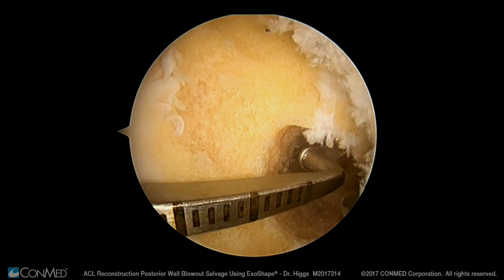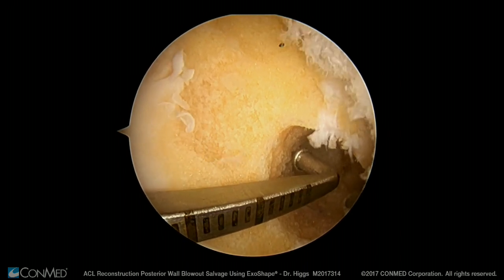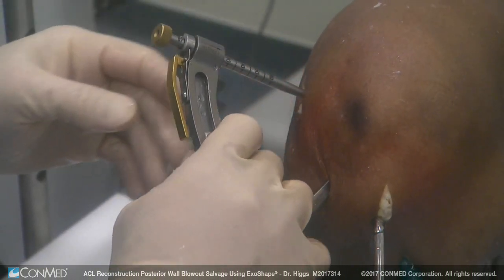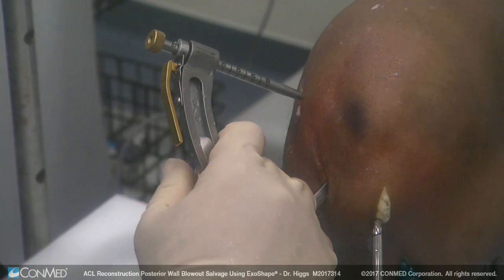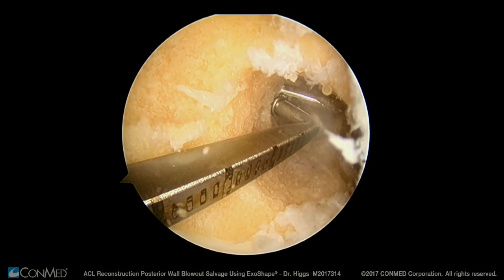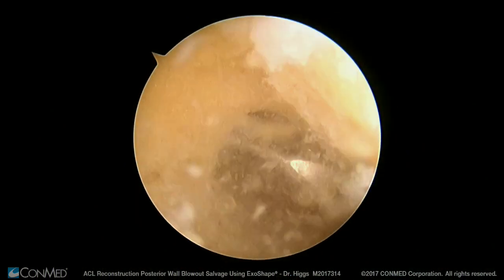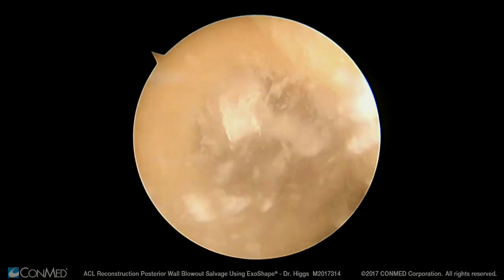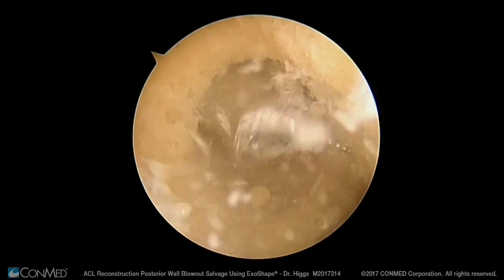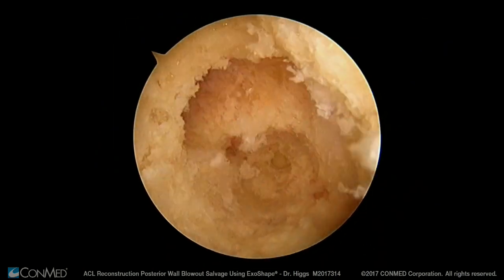The idea is to create a tunnel that enters this tunnel and then fixate the graft within that tunnel, which is perpendicular to this tunnel. I want to make sure I'm coming down from more superior to create my 30 millimeter tunnel. We've placed our guide pin and I'm simply going to ream over the guide pin, then ream the corner just a little bit to chamfer it because I have to make a 90 degree angle. Now I've created a tunnel that is at a 90 degree angle to my original tunnel.